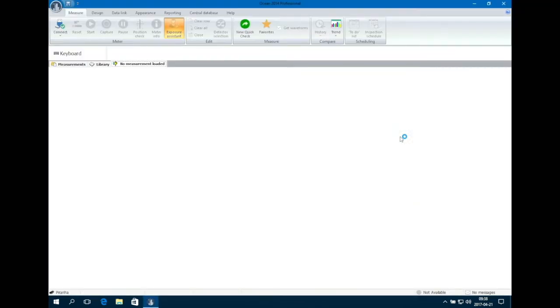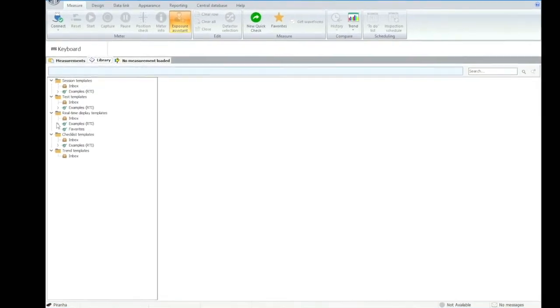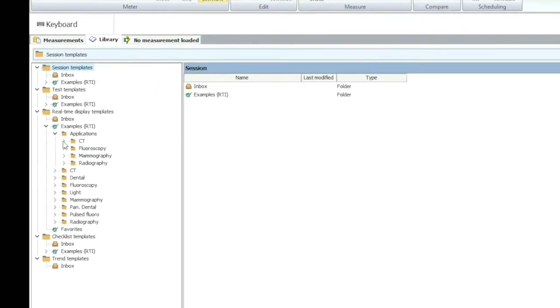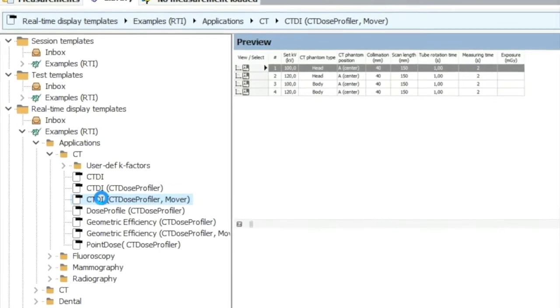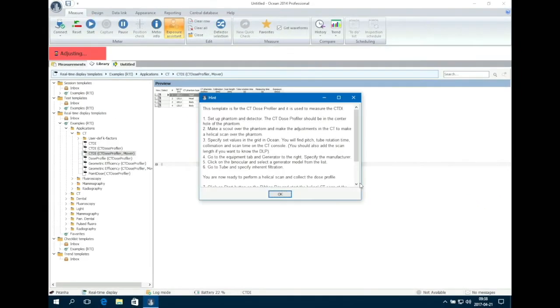For this measurement we will be using an existing template in Ocean. Open the library tab and go to real-time display templates and extract examples RTI applications CT. Choose CT DI CT dose profiler mover. A hint will appear. When ready click OK.